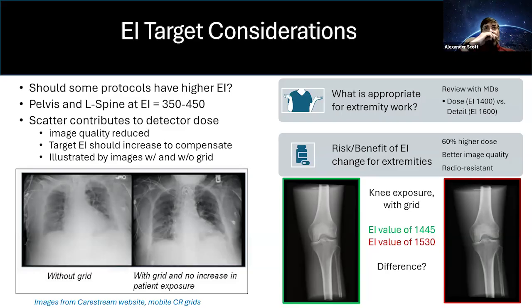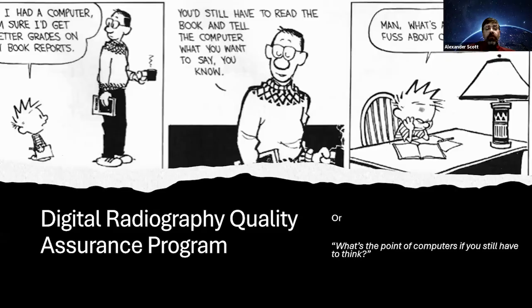So the question of whether you can keep lowering the dose really depends on how small or fine detail of pathology you want to see. For this knee phantom, it was a healthy knee, and he could see no appreciable difference between the two doses. So he went with the lower one.